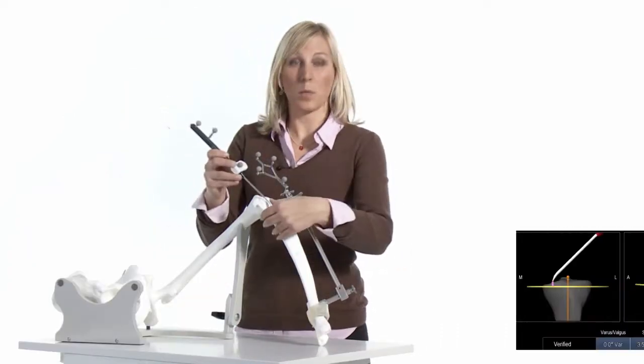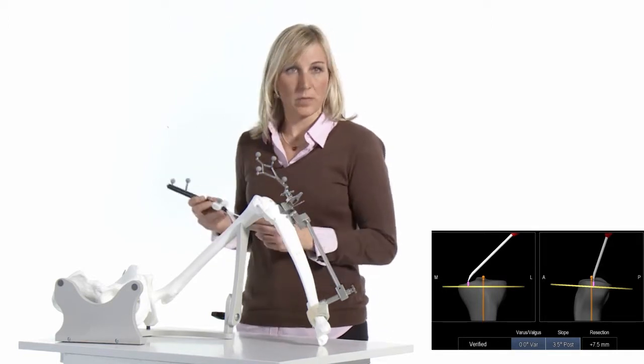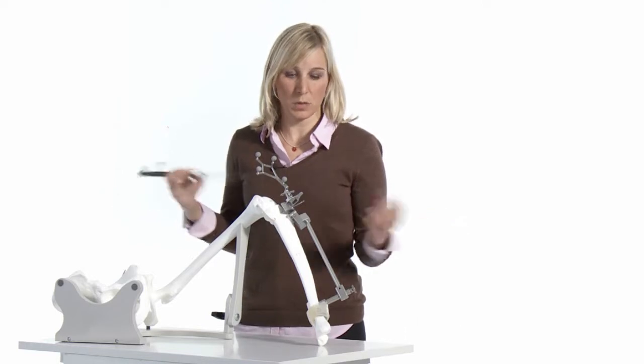Also, by placing the pointer on the tibial plateau, you see the planned resection height. Now you can decide if you want to make adjustments to the cutting block position.